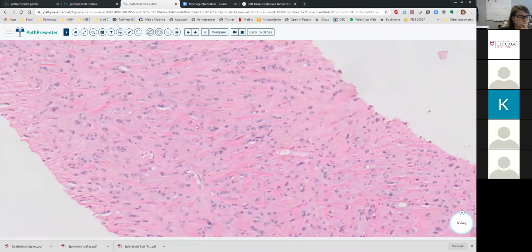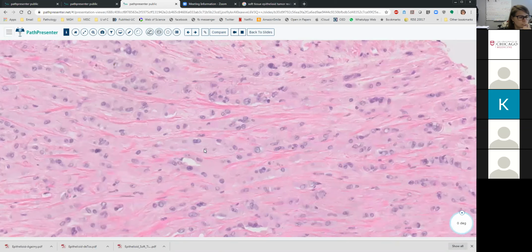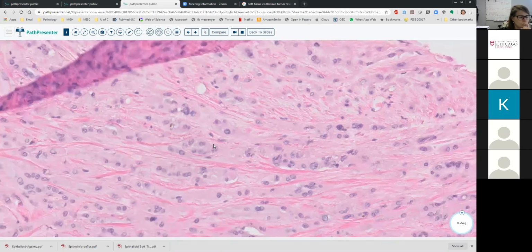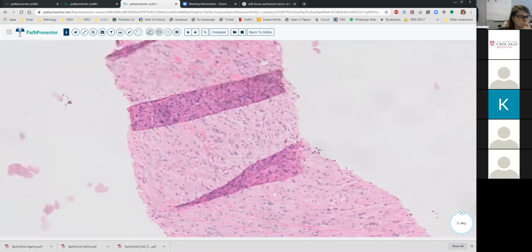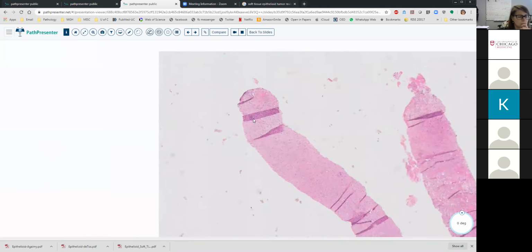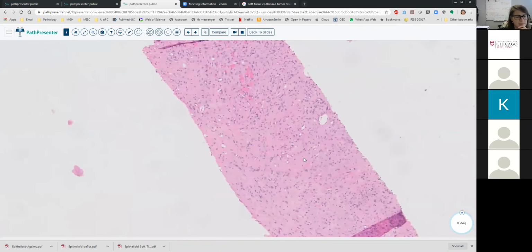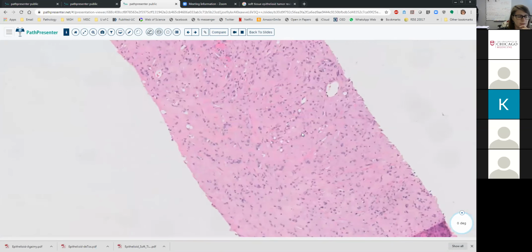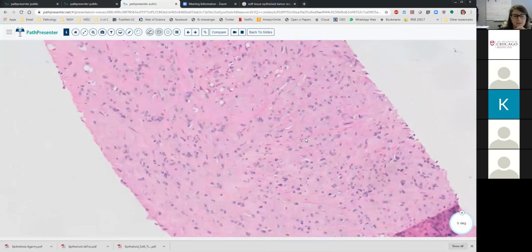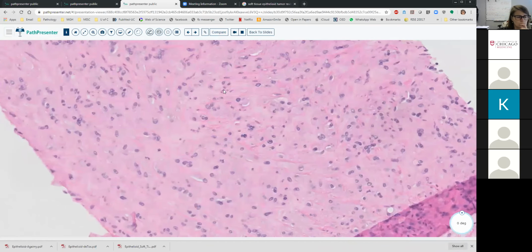If this is a de novo or unknown primary, you would want to do those anyway for prognostication and diagnostic and therapeutic purposes. Okay, so a GATA3, maybe some ER, PR. Anybody else want any other immunostains? I guess you could do mammoglobin or something like that.